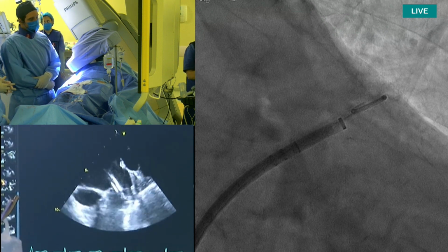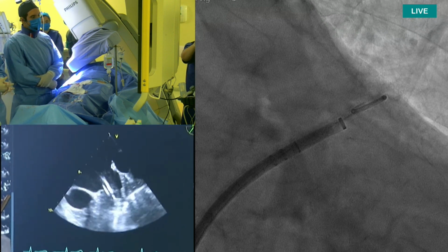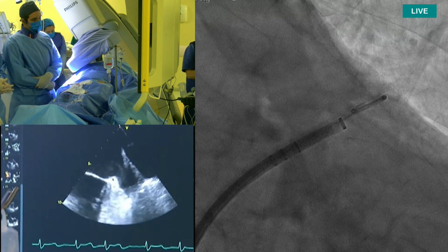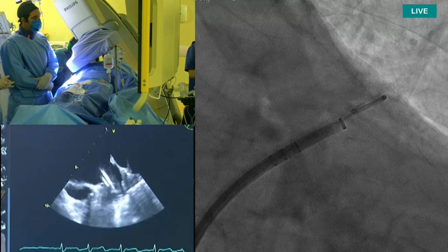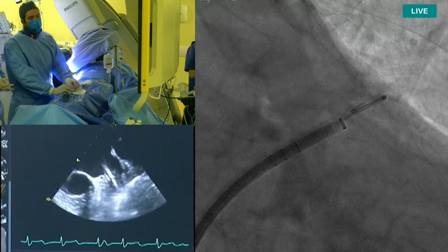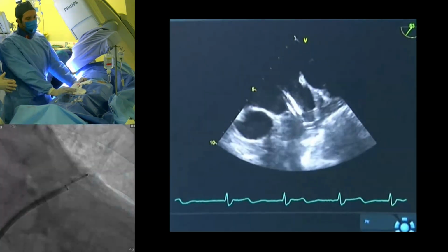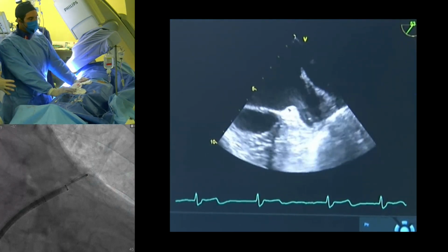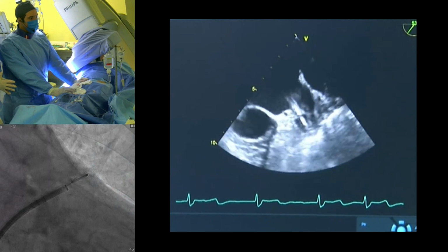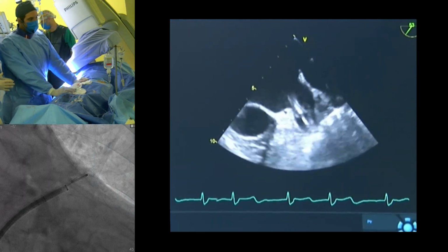It can go from this marshmallow to a hot dog compression, so it's pretty conformable, I would say. But okay, here I think we agreed on, and we would stick to the 31 millimeter device. Yes. 27 is for sure too small. 31 or 35, that's the question. We have enough depth, but we think we will have some shoulder with the 35, and we do not particularly like a lot of shoulder. So I think we're going to go for 31 here.